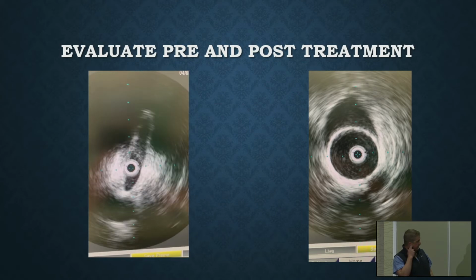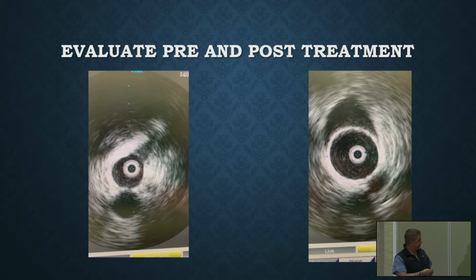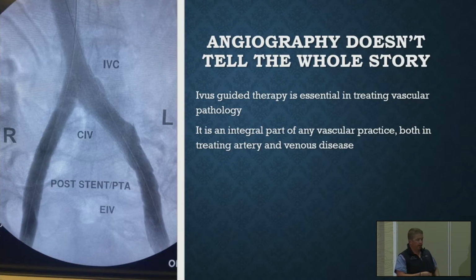So you can see the catheter is almost occlusive in that region. So angiography, this is a completion angiography after we reconstructed the images you saw previously. As you can see, all the splayed out portions are gone, and it just allows us to have a better, more accurate reconstruction of the vessel walls.